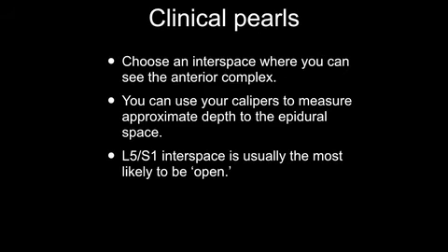Clinical pearls. Again, choose an interspace where you can see the anterior complex. You can use your calipers to measure approximate depth to the epidural space. This may be helpful in planning your needle selection or when you anticipate you should acquire CSF or loss of resistance. Typically, the L5-S1 interspace is the most likely to be open based on ultrasound information.